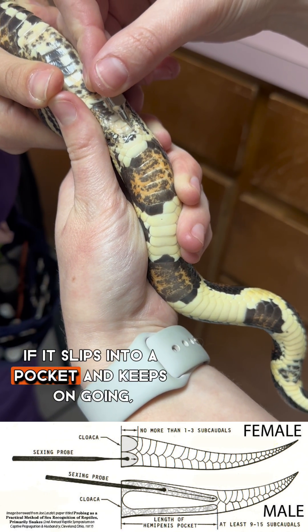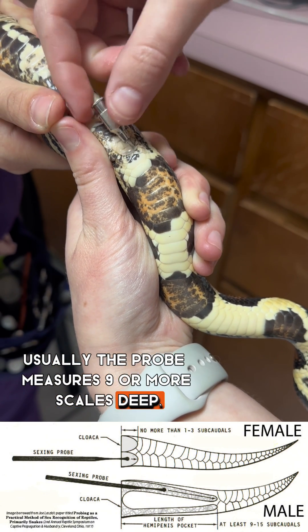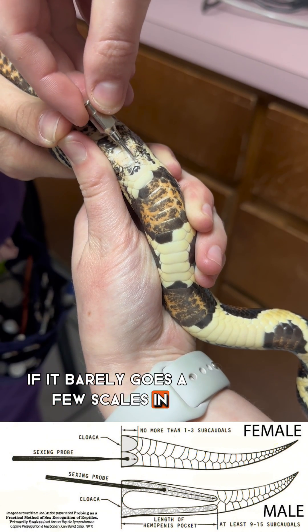If it slips into a pocket and keeps on going, congratulations, you have a male. Usually the probe measures 9 or more scales deep. If it barely goes a few scales in, then you have a female.